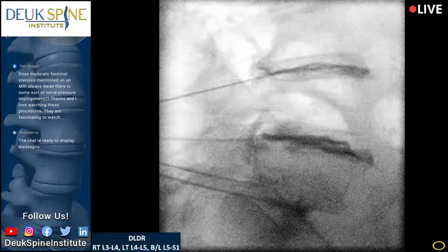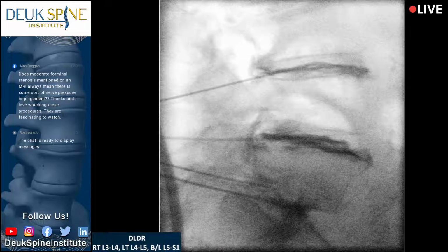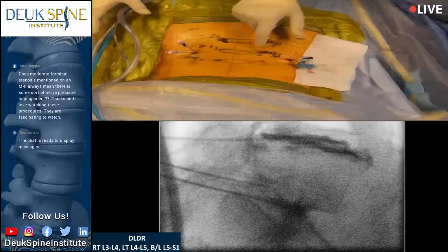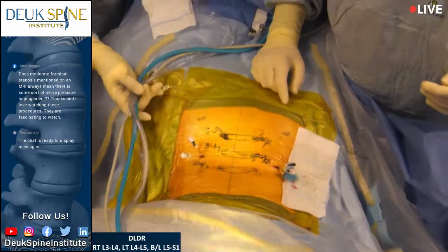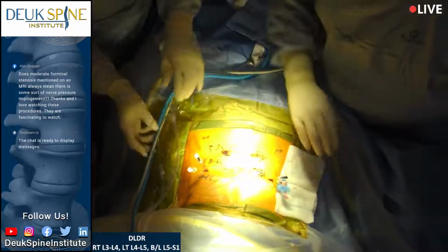I'm done torturing you. You didn't think you'd come to Florida to get tortured, did you? I'm so sorry. We're done. We tested all 3 discs, and all 3 are causing you 10 out of 10 back pain. And that's where you typically get pain, right? All right. I want you to count from 1 to 100 in French. Can you do that?